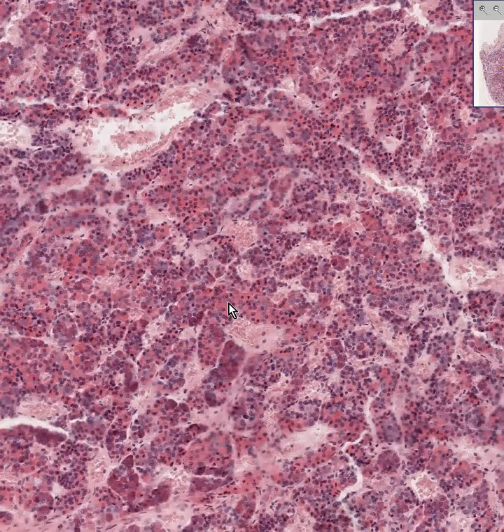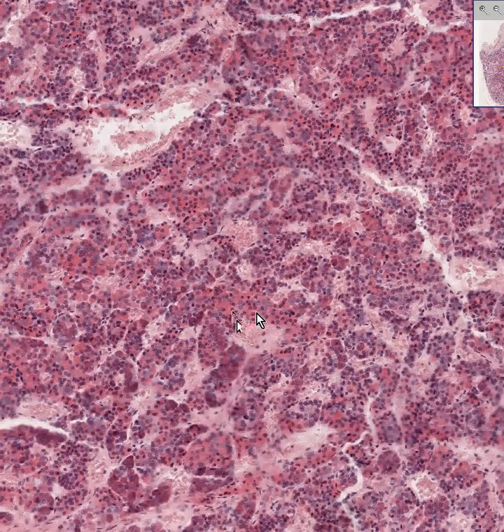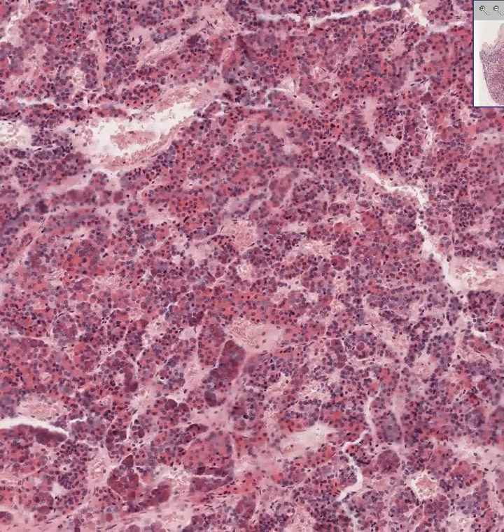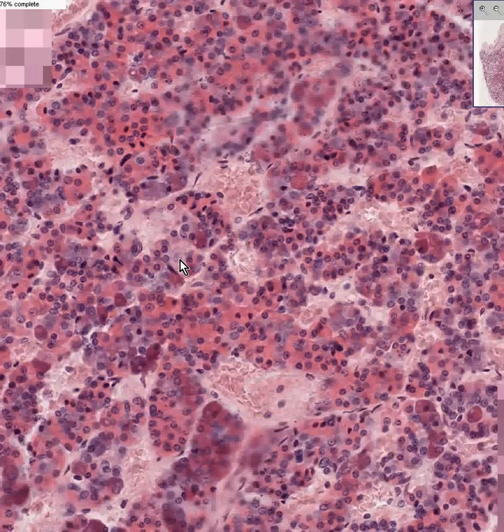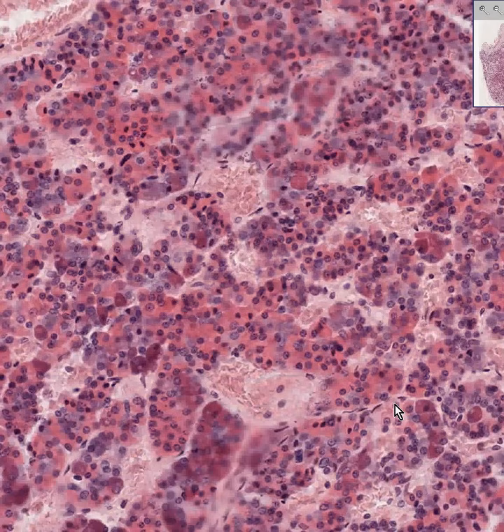The acidophils secrete everything else. They secrete growth hormone. They secrete prolactin. And the cells which do not take up color, like here, because it's afraid of color, so it's called a chromophobe, and I could get you a better view of one. The cells which do not take up color, like here, and we'll find some more. Here's one. Here's one. Sometimes there's a good number of them, and sometimes you have to look hard. These are the chromophobes. They don't secrete anything.